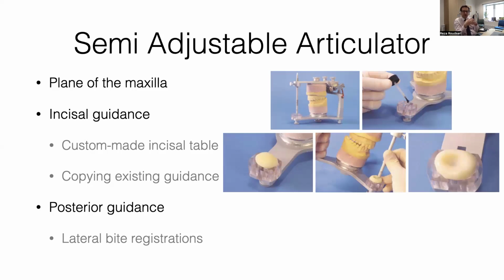You already got either chairside new temporaries based on your wax-ups, or you have taken an impression, either digital or analog, and have got some provisional, either composite or PMMA, crowns that you would like to try for a couple of months on the patient before you commit to your real ones.